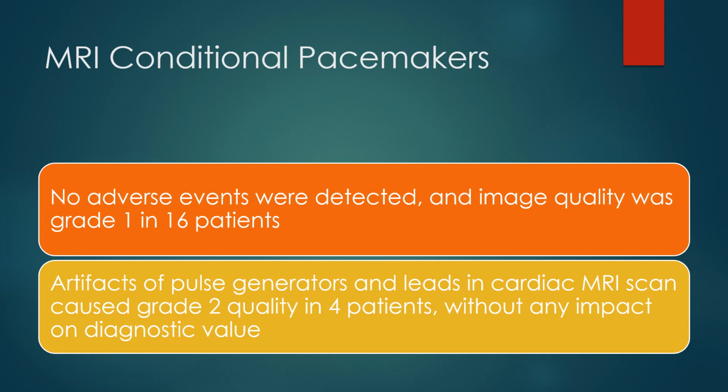No adverse events were detected and image quality was grade 1 in 16 patients. Artifacts of pulse generators and leads in cardiac MRI scan caused grade 2 quality in 4 patients without any impact on diagnostic value.